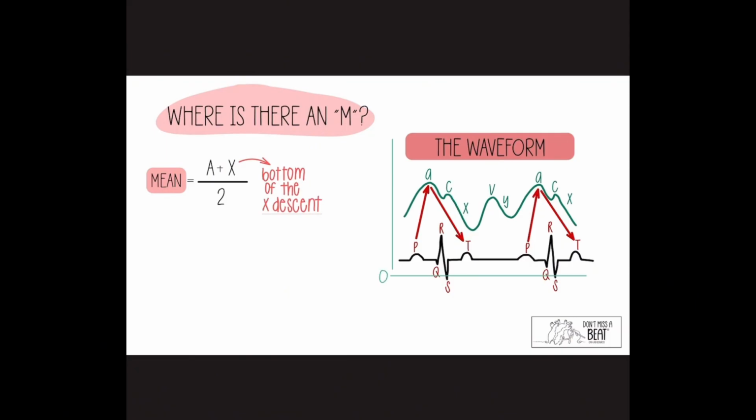Let's say this is 0. I'm just going to put 10 here so it's easier, and 15. So your A wave you would measure as what? 15. So if we were drawing, let's say this is pulmonary wedge pressure, we were writing our pulmonary wedge pressure is equal to A, which is 15, over the next one, which is V. And your V wave is about here, so between 10 and 15, we could say this is 12, this is 13. And then the mean we have to calculate.